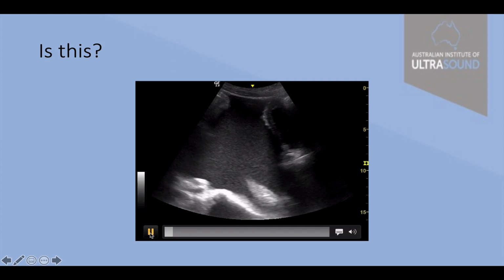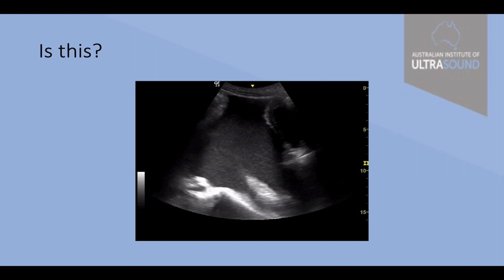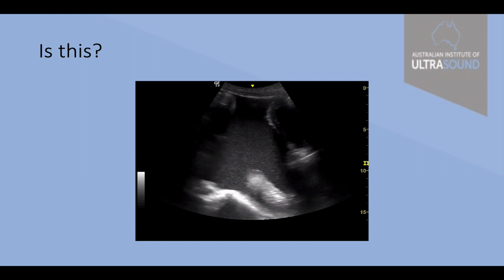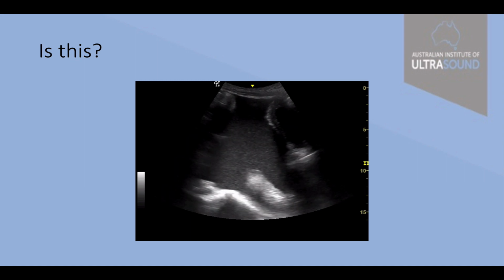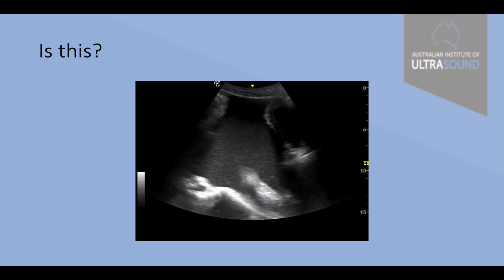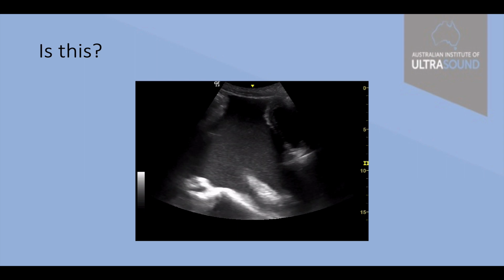This one is, I don't know where, I think in someone's abdomen. And what I want you to note specifically is that very faint swirling. I think Lichtenstein calls this the plankton sign when he's referring to lung effusions, as if tiny particles are swirling by themselves within the fluid.